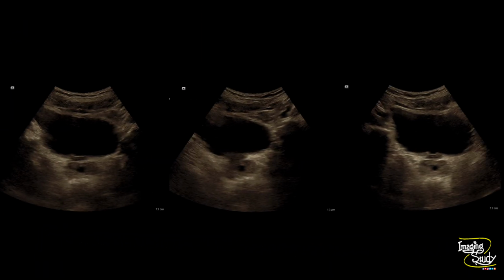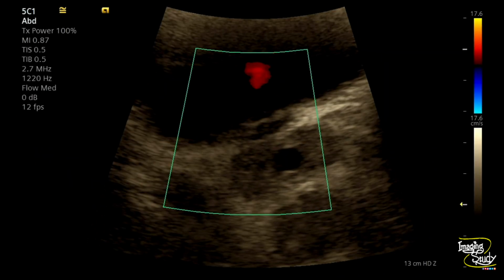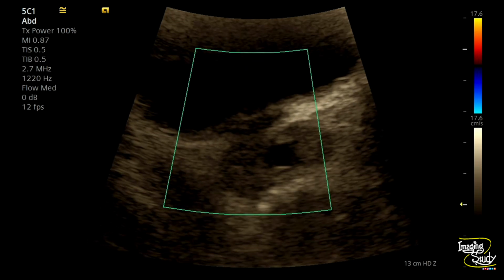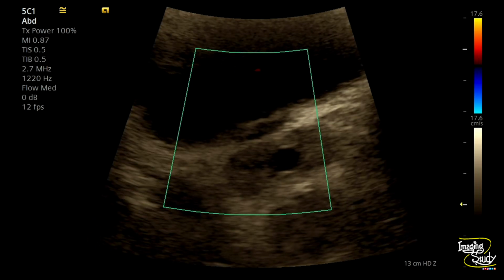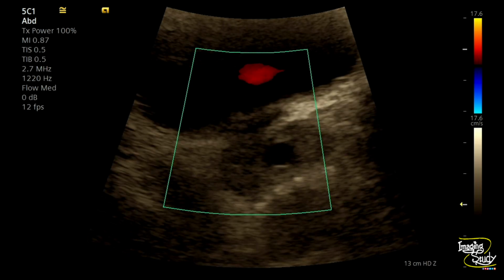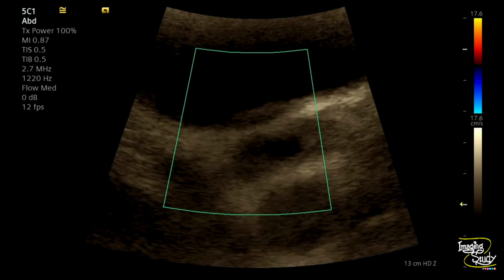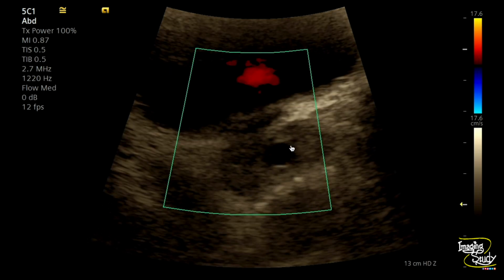Here is again 3 pictures with the prostatic cyst at the midline. Now it might be due to the vascular abnormality, which is extremely rare. So we put color Doppler. We always suggest you to put color Doppler if you see any pathology, no matter what is the finding, but you should know what is the color Doppler finding of that lesion. So on color Doppler, there is no vascularity, no adjacent vascular abnormality.